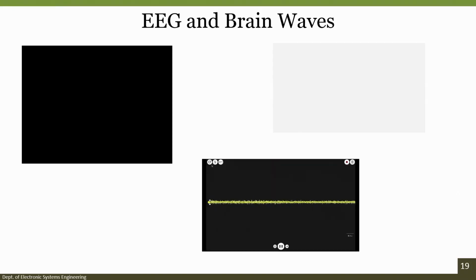Click on the settings button in our Spike Recorder software and select Connect via USB port. Within a couple seconds, you should see the signal change to a putative EEG signal. You can zoom out of the timescale by using the two-finger motion on your trackpad or the scroll wheel on your mouse, and zoom in on the y-axis by clicking on the positive button on the left side of the screen. But how do we know this EEG signal is real?